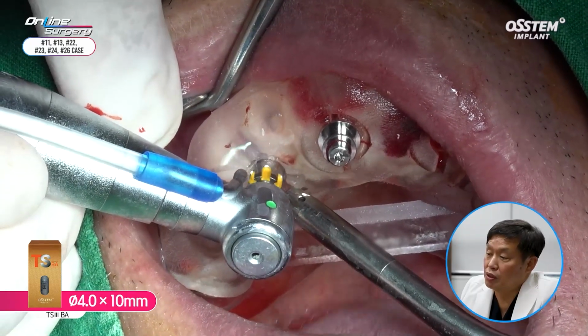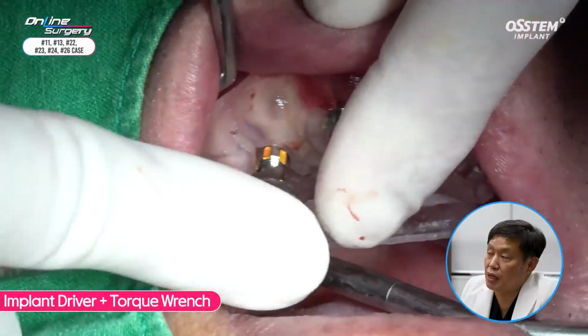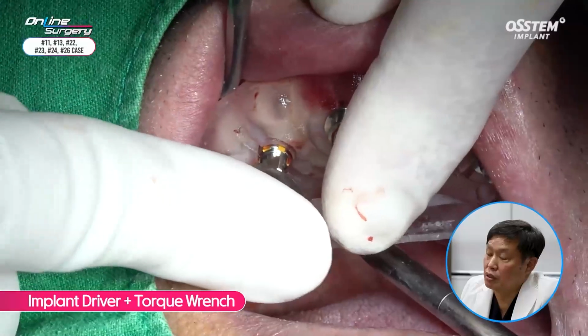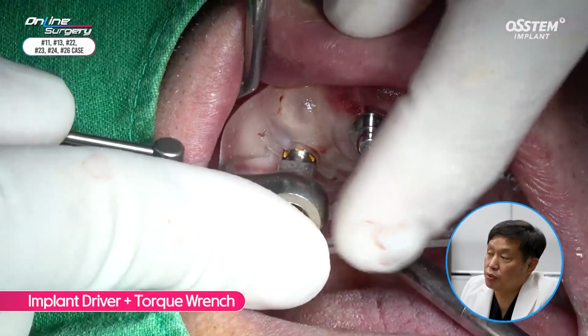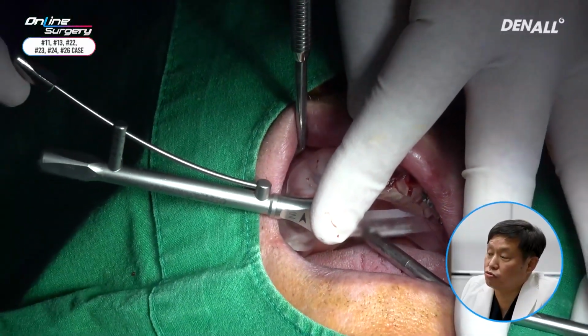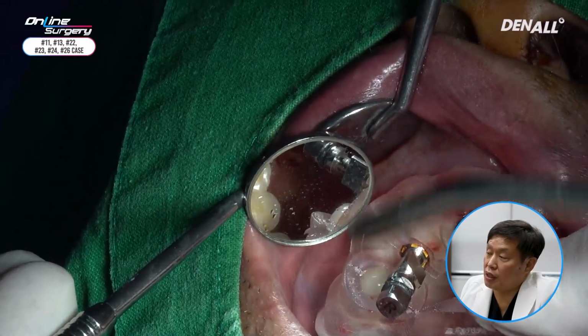Saline was applied in number 13 as the 4.0 by 10 mm implant was placed. The implant driver and torque wrench were used to adjust depths and hex positioning. Primary stability was over 30 Newton centimeters. Number 13, position was checked.